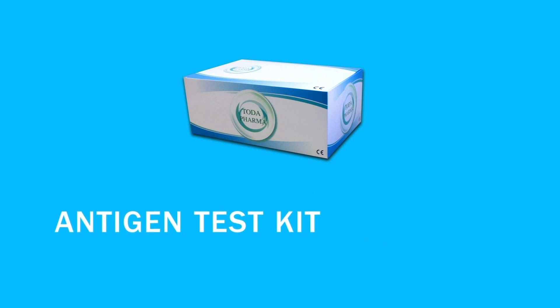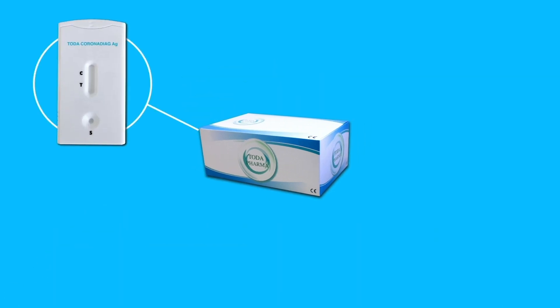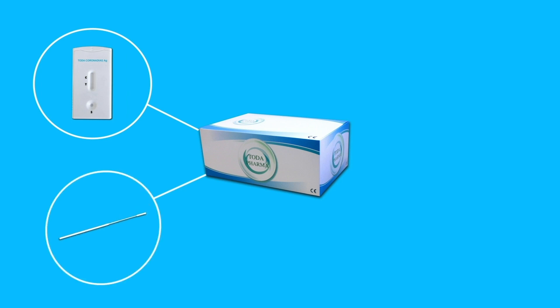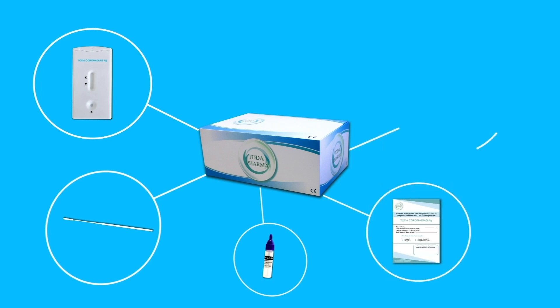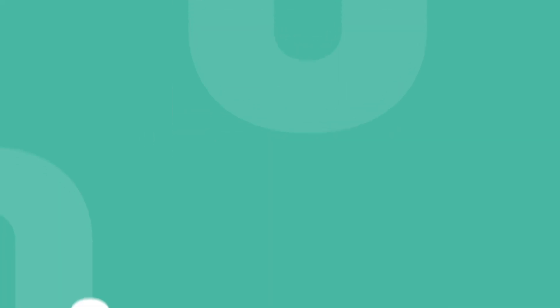Toda Coronadiag Ag is an antigenic test kit for the detection of coronavirus consisting of a test cassette, a swab for sample collection, one bottle of individual buffer solution directly ready to use, a brochure for tracking patient results, and an instruction manual. The tests are available in boxes of 10 or 20 kits.